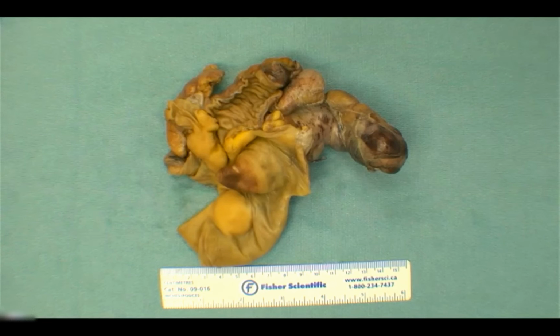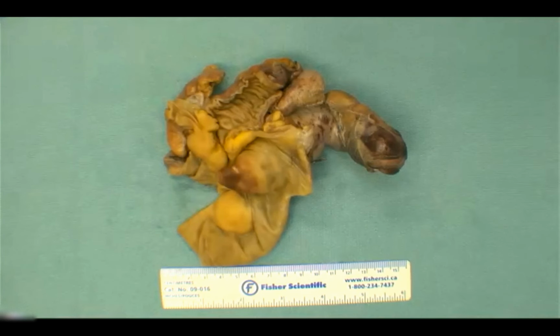We've got a vote for mucocele. Excellent. Good. Or we've got the LAMN. And for the benefit of those that may not know what a LAMN is, could we spell that out? And even for HAMN, whatever HAMN is. So a LAMN is a low-grade appendiceal mucinous neoplasm. And then HAMN, just swap out the L for high grade. It could be an adenocarcinoma, absolutely. Ooh, NET. Could be. Please spell it out. Oh, giant gum bezoar. A NET is a neuroendocrine tumor.